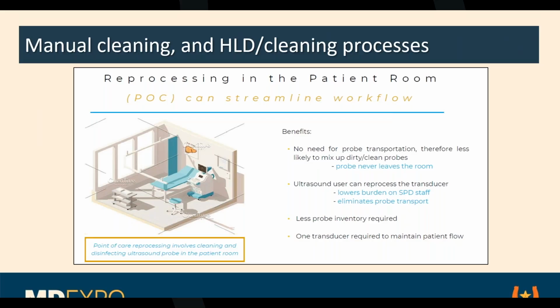They don't necessarily have to transport it anywhere or go pick something else back up. I can't speak for 100% of them, but I know a lot of them have it right there, so transport is not a big issue, but storage can still be. There's a temptation to just put it back on the rack on the ultrasound machine, which isn't the way to do that.